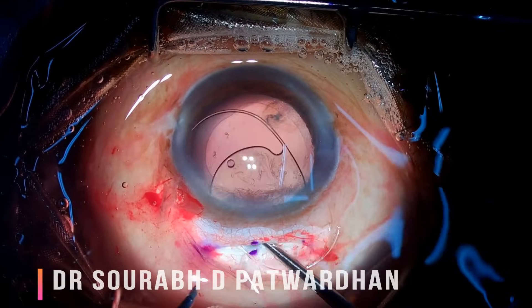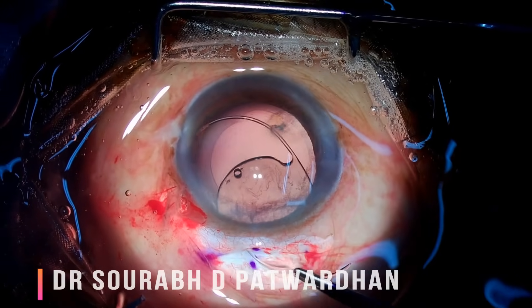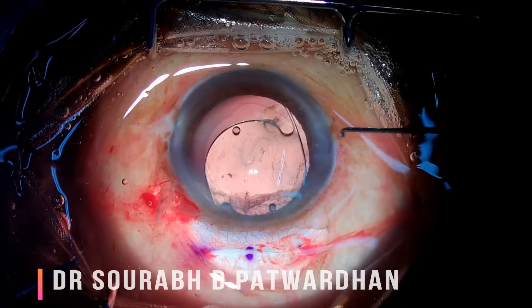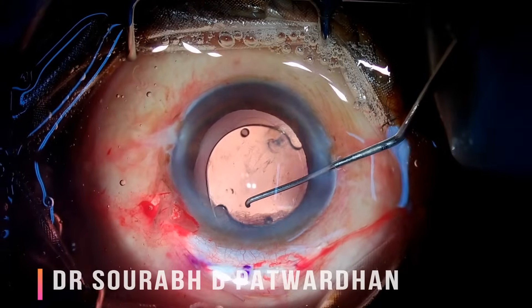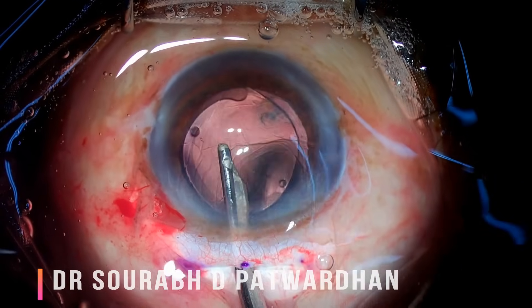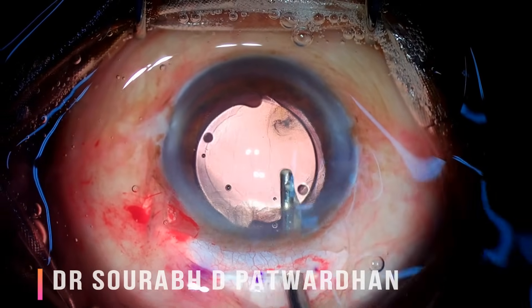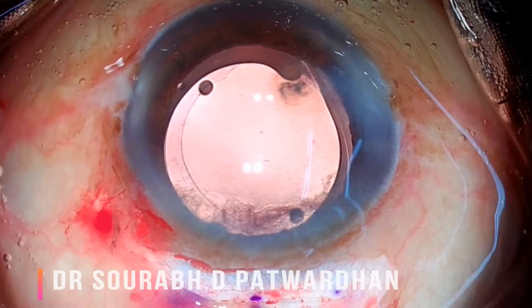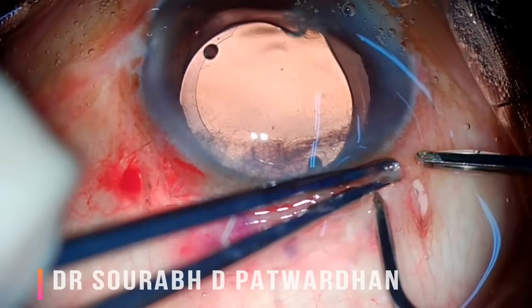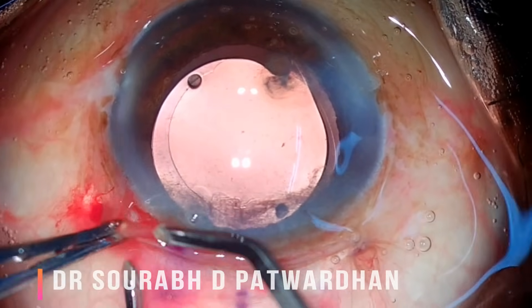This is the implantation of a PMMA non-foldable IOL. You can see the 6-millimeter optic just snugly fits into the incision, confirming that my incision size is exactly 6 millimeters. The method is: rotate the leading haptic into the back, then — using the side port with a Sinskey dialer — push the optic into the back, and then rotate the trailing haptic in. So it is three steps: first place the leading haptic, second push the optic in, third push the trailing haptic in. Then do a thorough wash of the entire chamber because we are using the low-flow Simcoe system — take time to wash all the viscoelastic, otherwise you will have raised intraocular pressure the next day.